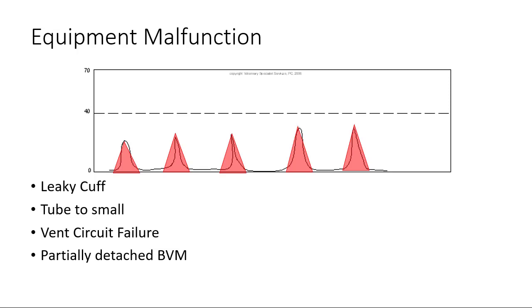That could easily cause this, but you need to figure it out, and figure out immediately, because you can't leave it like this. If it's like this and you can't figure out why, you need to consider if your tube's misplaced somehow. And by that, could be right at the tip of it, hanging right in the glottic opening, but the cuff is out of the glottic opening and it's just waiting to be dislodged. That's the worst case scenario.